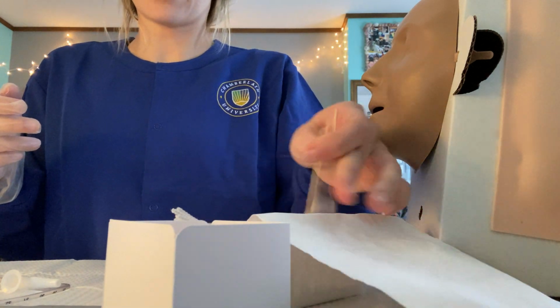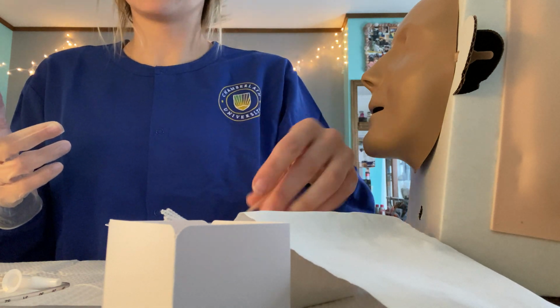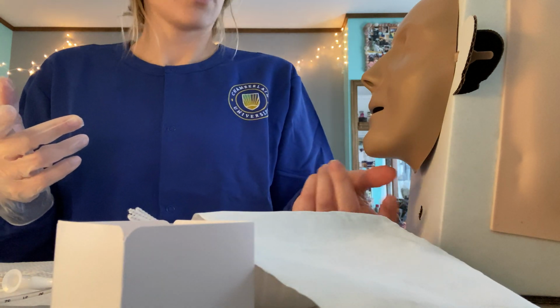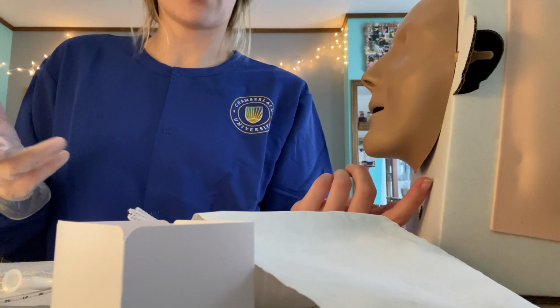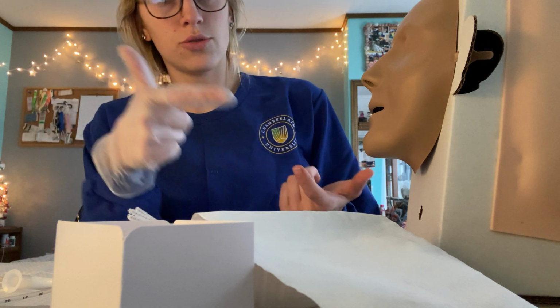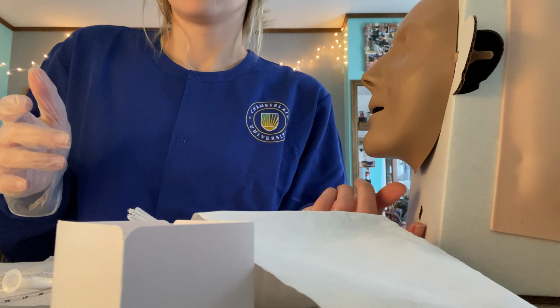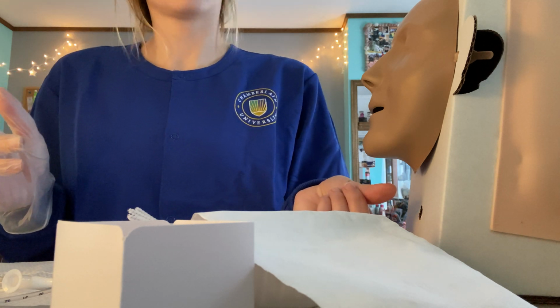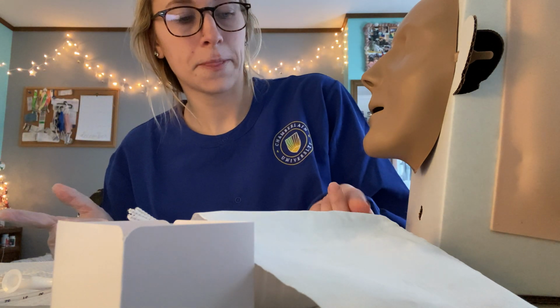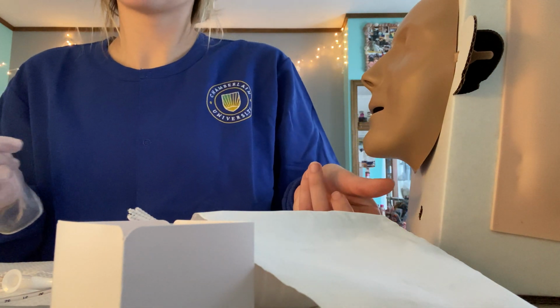So then now what I'm doing with my non-dominant hand is I am going to remove the trach mask and the inner cannula, and then I'm going to gently insert a new inner cannula into my patient's trach. So I'm gently inserting the new inner cannula into the tracheostomy, following the curvature, and I'm making sure that it fits, it is secure, and then I make it lock in place.